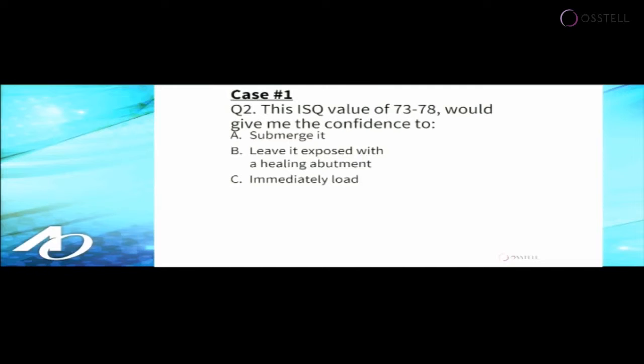And for my advanced clinical training students, you better answer this right. So can the ISQ numbers give us the confidence to provide a certain loading protocol? Jeff?